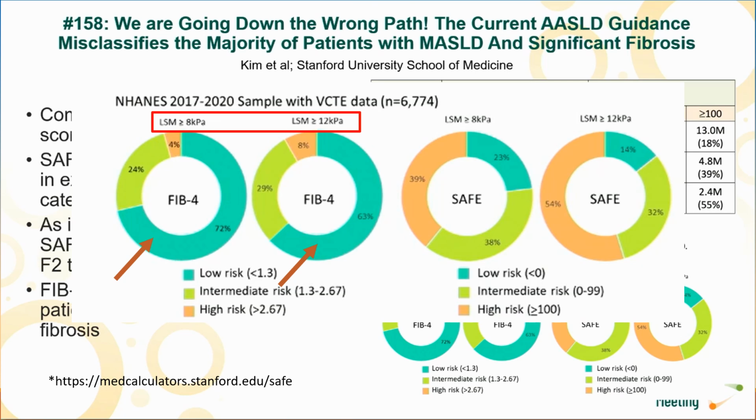And as someone in the audience correctly pointed out, an elevated liver stiffness does not fibrosis make. However, the point made here is that the same patients who, based on their liver stiffness, would warrant specialty evaluation according to the guideline would be deemed to be safely triaged to primary care based on their FIB4 per the same guideline. So the conclusions of this chapter.